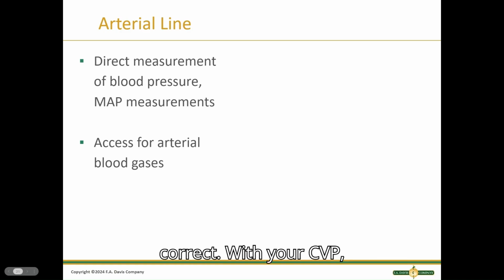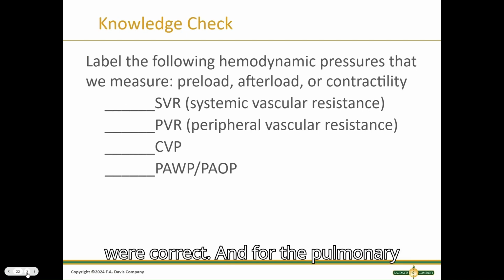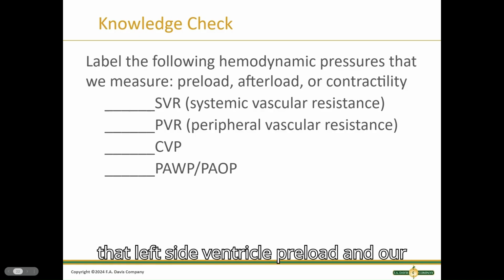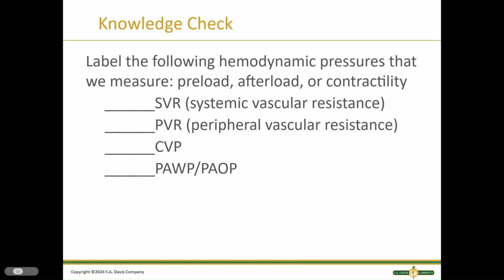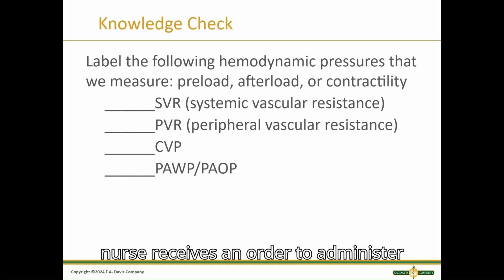An arterial line is for monitoring and blood collection only. We do not want to draw or infuse any type of medication through this port. And once removed, we're going to hold pressure possibly up to 5 minutes to make sure we have adequate hemostasis.